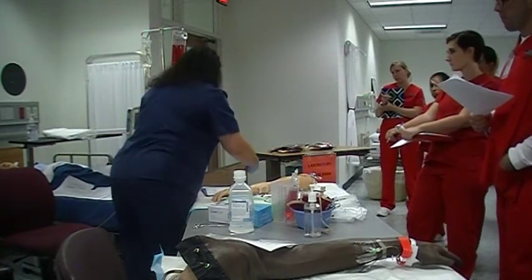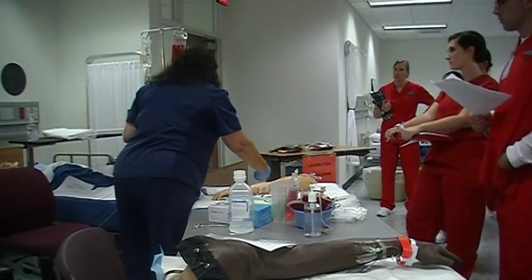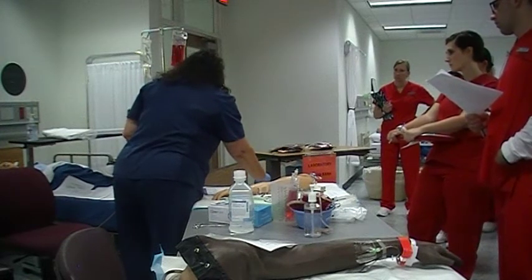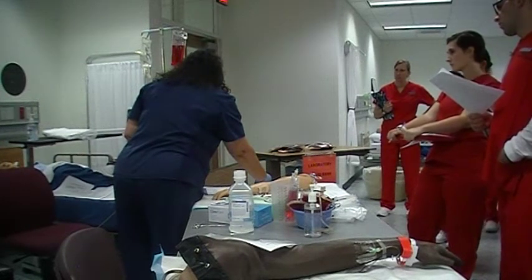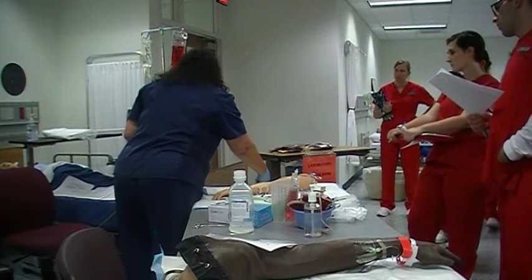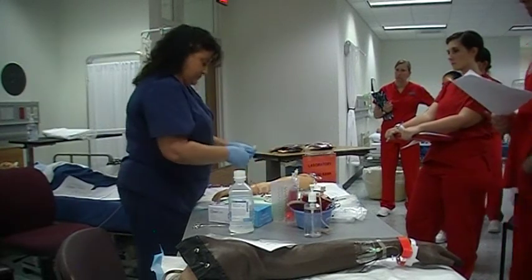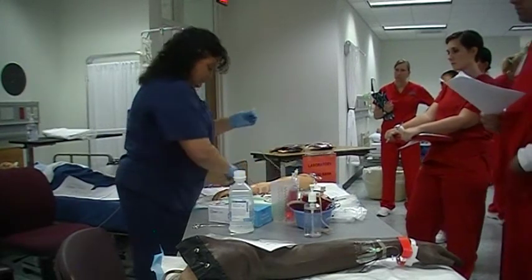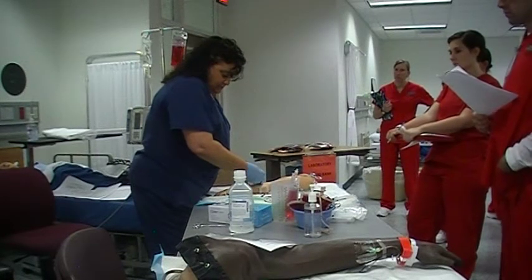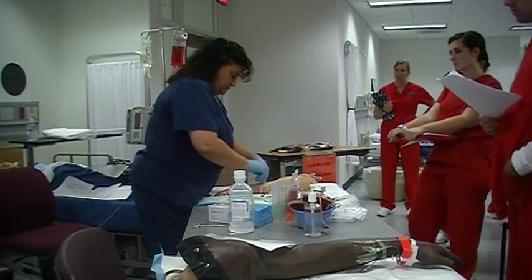So you're going to run it through until the blood gets about right above my hand.